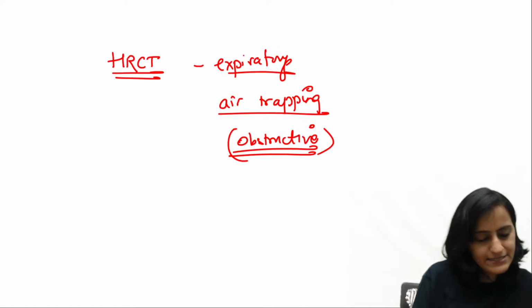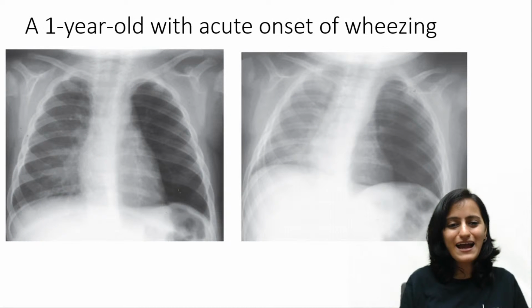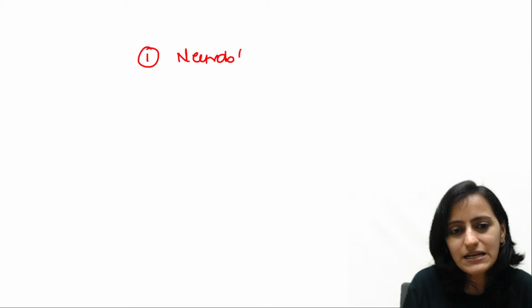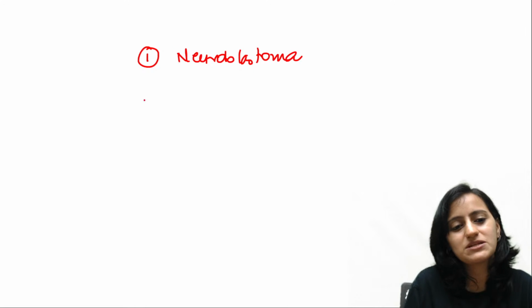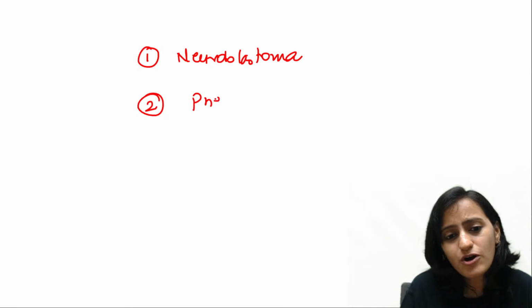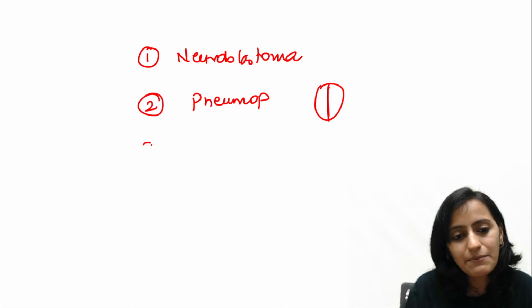All right. So those were the cases that we had for today. The 5 cases that we saw in pediatric radiology. First one, neuroblastoma: calcification, midline crossing and skull metastasis. Then we saw pneumoperitoneum, the football sign in the center, and the ligament.